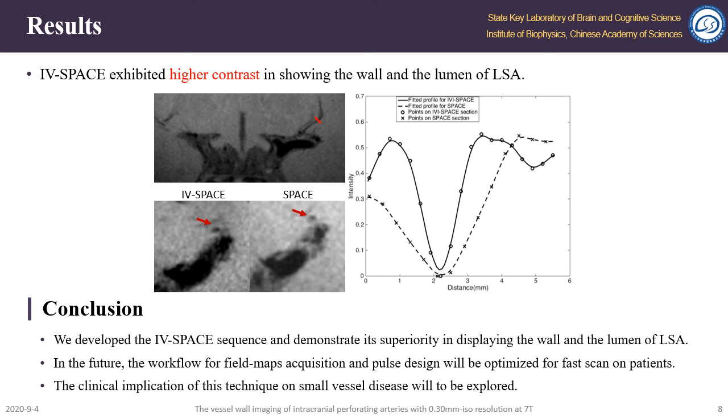In the future, the workflow for field maps acquisition and pulse design will be optimized for fast scan on patients. On the other hand, the clinical implication of this technique on small vessel disease will also be explored.